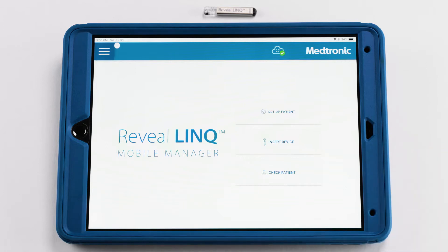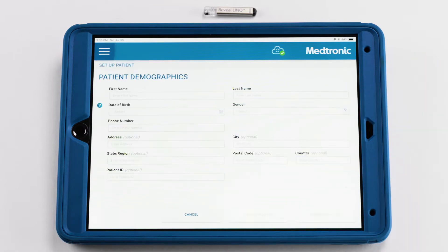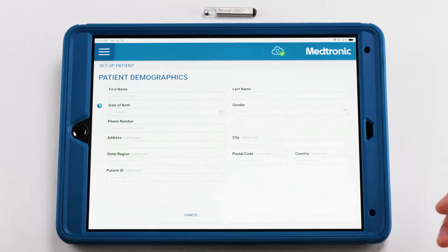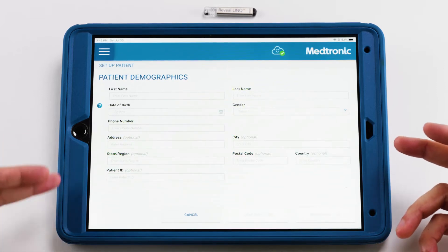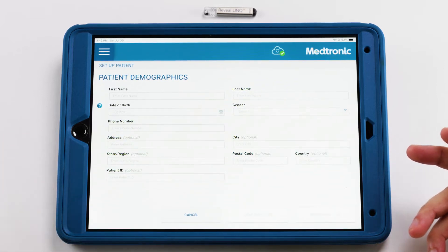You're able to set up the patient up to seven days prior to the insertion date. Doing this ahead of time optimizes the workflow and prevents intraoperative delays. When filling out the patient demographics, the best practice is to complete all of the fields on the screen, including the ones that are labeled as optional. This will ensure a smooth registration of the patient into the CareLink network.